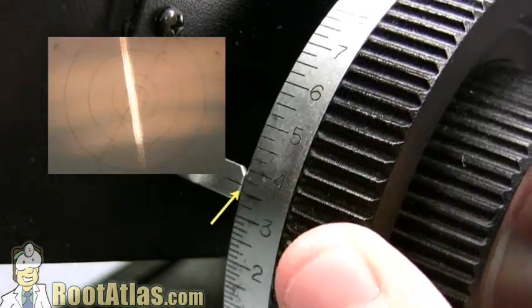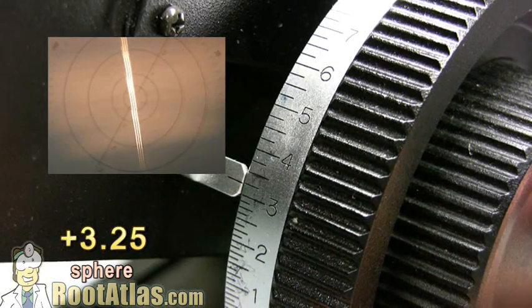If you look at our dial here in our focus, we can see this is a 3.25. That is the sphere. The sphere is 3.25.